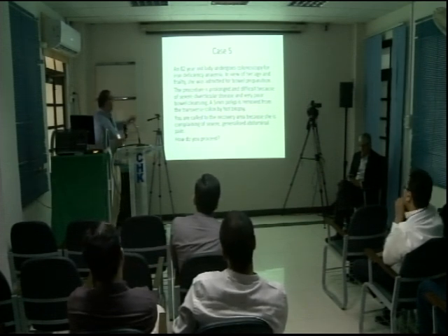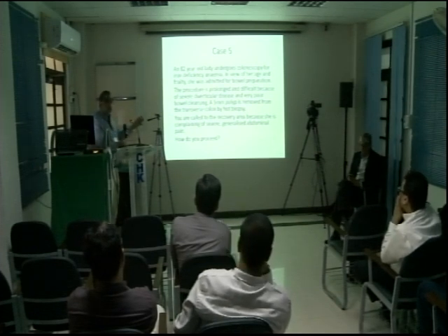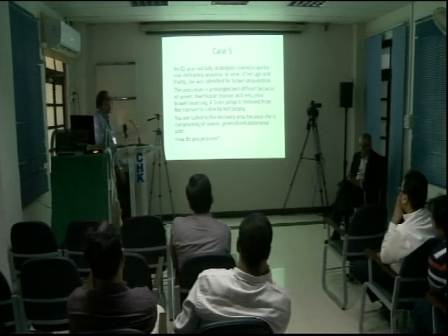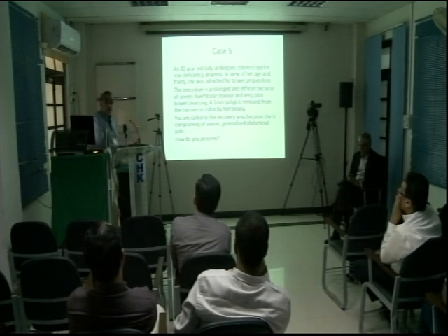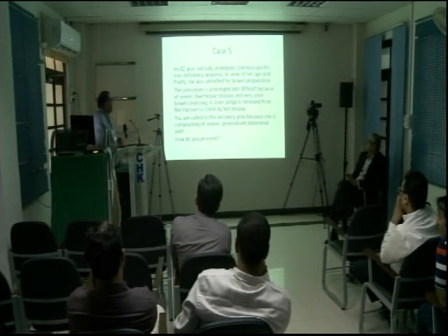अच्छा दूसरा ये केस: 82-year-old लेडी अंडरगोज कोलोनोस्कोपी फॉर आयरन डेफिशिएंसी एनीमिया. अब आयरन डेफिशिएंसी एनीमिया ऐसी चीज़ है कि इसमें आप करते हैं कोलोनोस्कोपी, ये इन्वेस्टिगेट करते हैं. In view of age and frailty she was admitted for bowel prep. ठीक है, these are all real cases. The procedure is prolonged and difficult because of severe diverticular disease. It is very common there. यहाँ पे आप लकी हैं. यूके में diverticular disease बहुत common है, especially जिस औरत की diverticular disease भी और previous hysterectomy भी हो. They are a nightmare. And she had very poor bowel cleansing. ठीक है, so that is again an important factor to note.